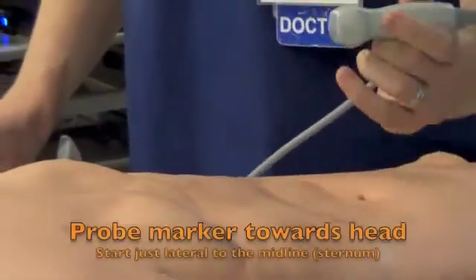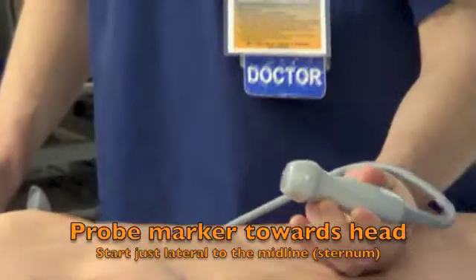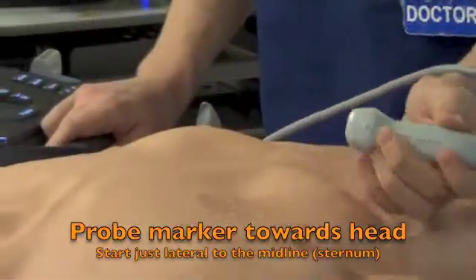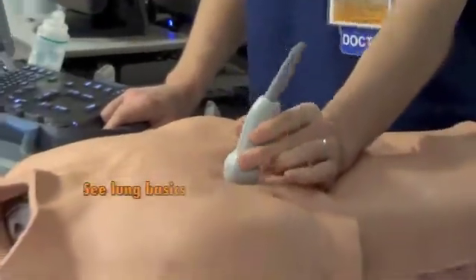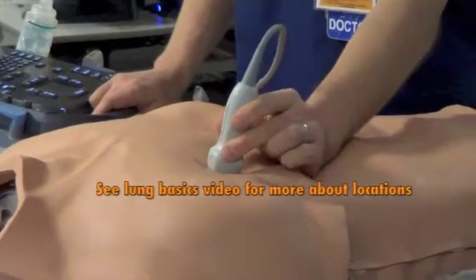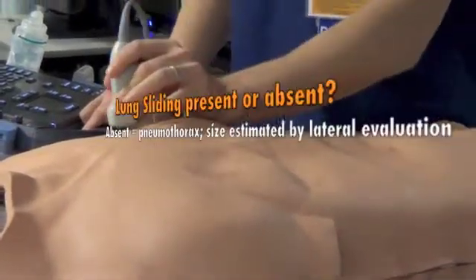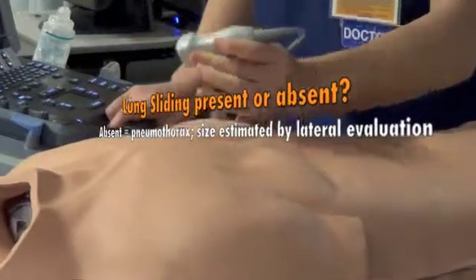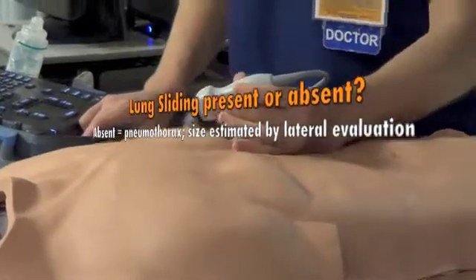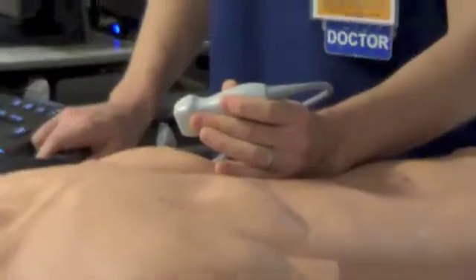To initiate the exam, the first thing we're going to look for is lung sliding. You can look at the BLUE points of the patient by placing the ultrasound probe as indicated here. If lung sliding is present bilaterally, then pneumothorax has been effectively ruled out.